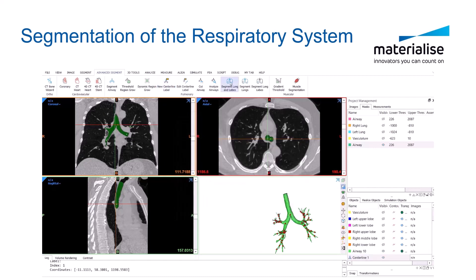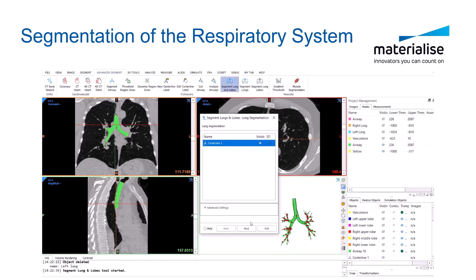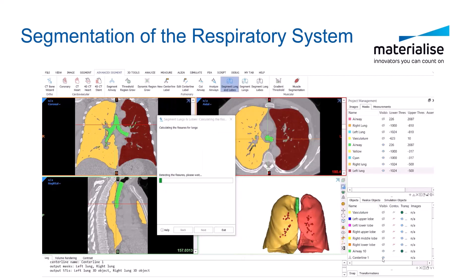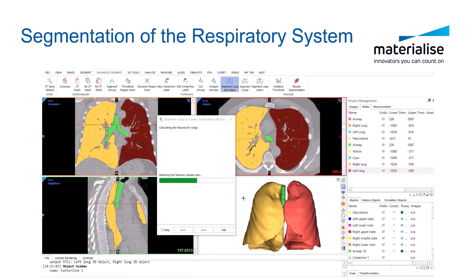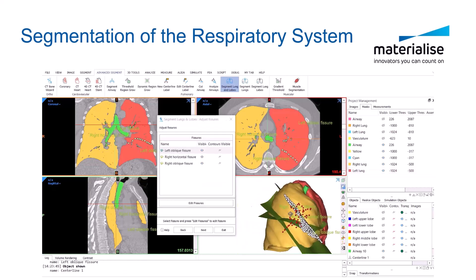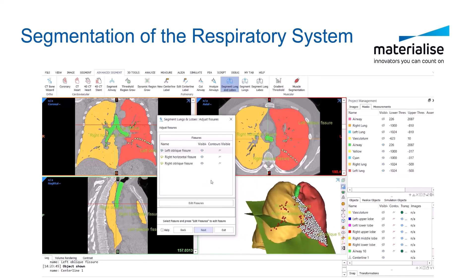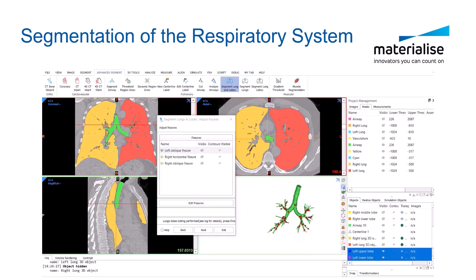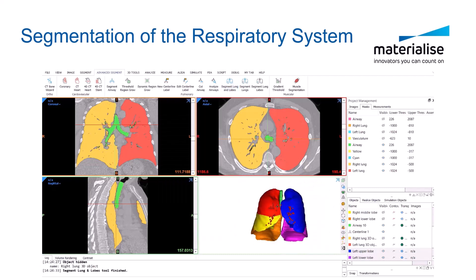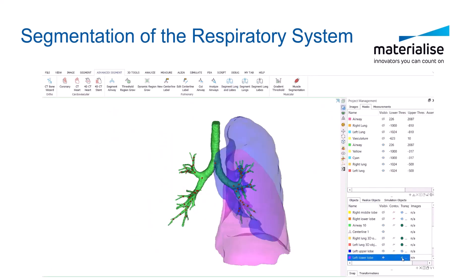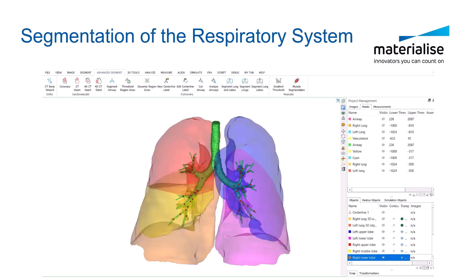And finally, segment the left and right lungs automatically and auto-detect the fissures to create the lung lobes automatically. This will help to create a beautiful segmentation of the respiratory system.